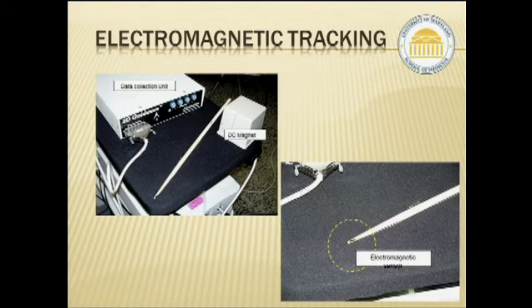We also used a second method, tried a different tracking methodology. This is a DC active magnetic tracking system, and this was another probe that we had. Now in this case, we can track both the proximal or distal end of the instrument.